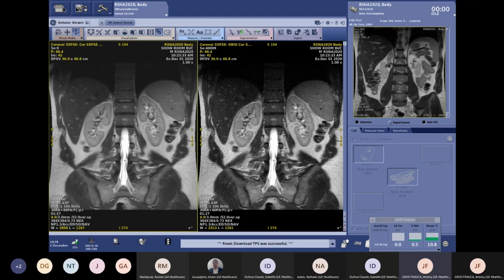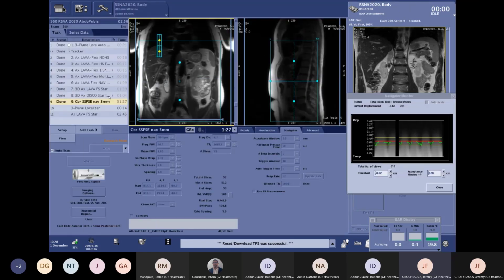So I think with what we covered today, you were really able to taste the large panel of solutions that we are proposing to our customers. I mean, I think for each situation we have a solution ready.